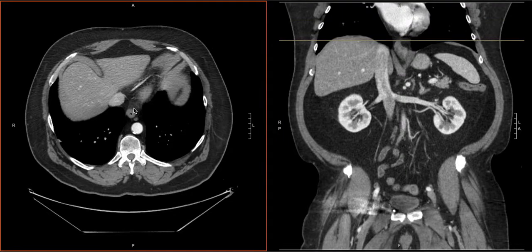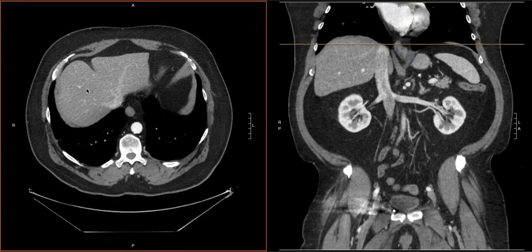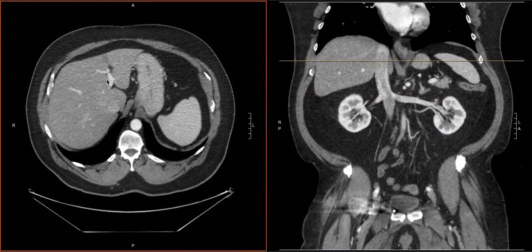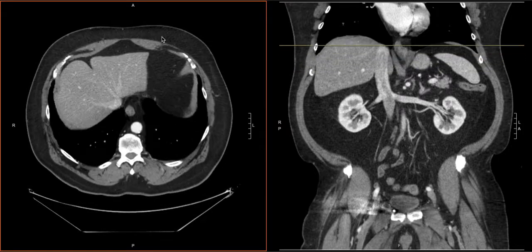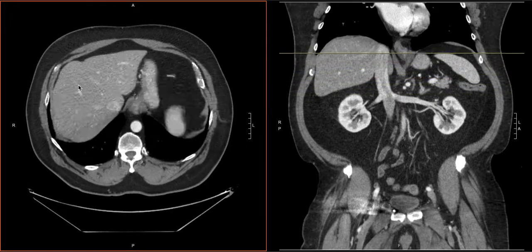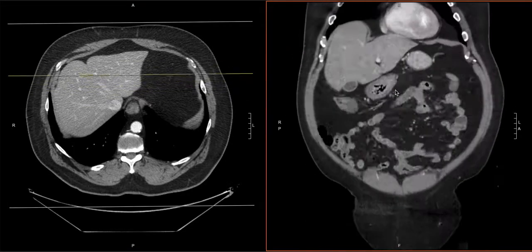Now, after we finish looking at the heart, we can very smoothly transition to the liver over here. Then we can go up and down and look through the liver parenchyma for any lesions, any abnormalities. But this liver is looking pretty good. This is our liver here. And again, you can always go and look on the other views as well to help orient yourselves.